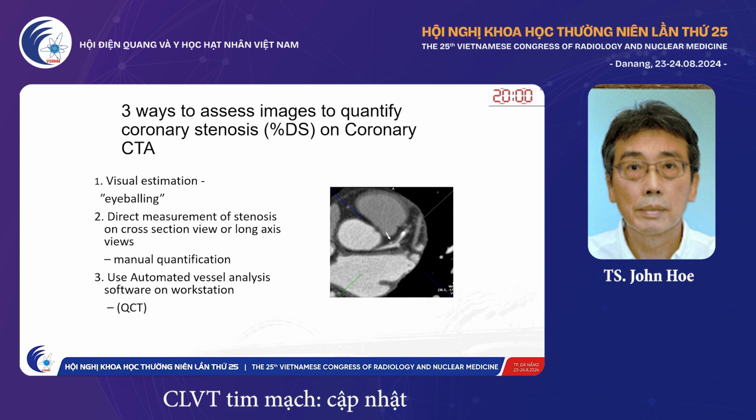The first is visual estimation, or eyeballing, which is what we do every day. You can do direct measurements of stenosis on cross-sectional views, on long axis views. That's called manual quantification, or you can use the semi-automated vessel analysis software on your workstation, which is called QCT.